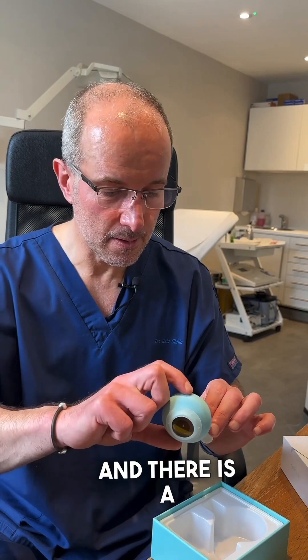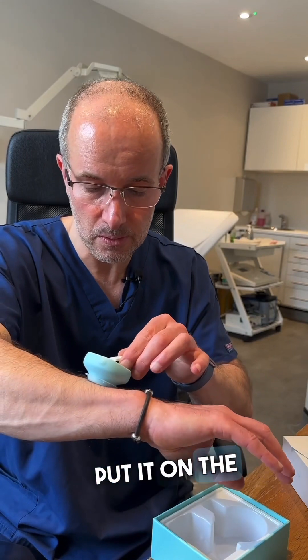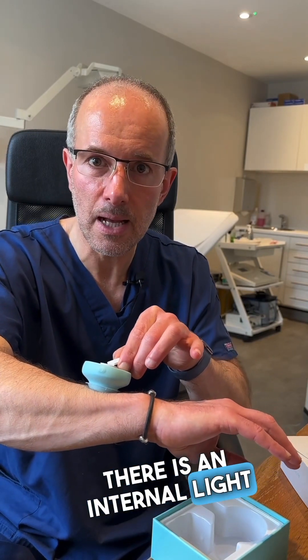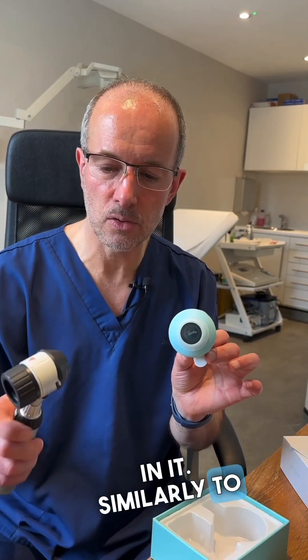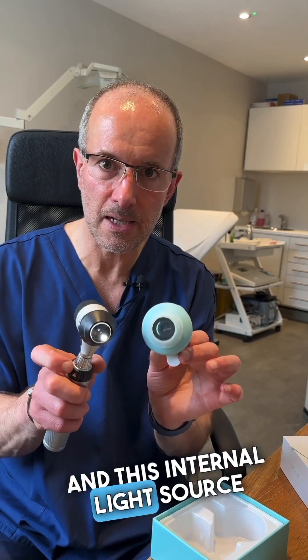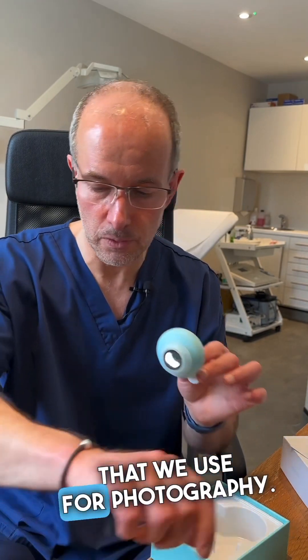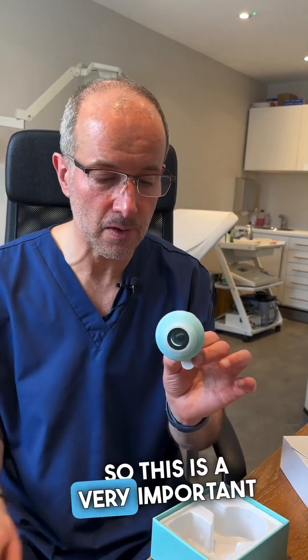There is an on/off switch up here, and this is the internal light. When you put it on the skin, there is an internal light source, similarly to my professional dermatoscope, and this internal light source provides the light used for photography — a very important part of the dermatoscope.